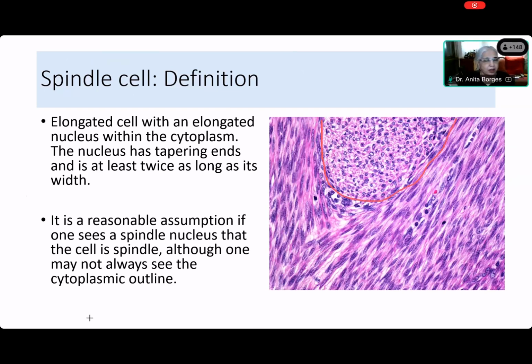That area. All right. So now you're saying that the nuclei over there are not spindle. Do I get you right, Shashank? Yes, ma'am. Very good. And they are oval or they are round. Isn't that right? Yes, ma'am. Excellent. So what was polygonal over here? Ma'am, some nuclei are different. Not typically polygonal, ma'am. They are almost oval. So then use the word that you want to use. Ma'am, round to oval.